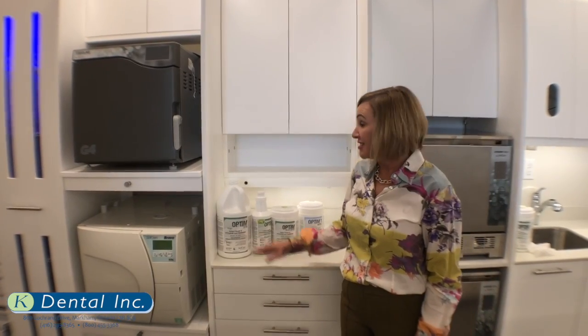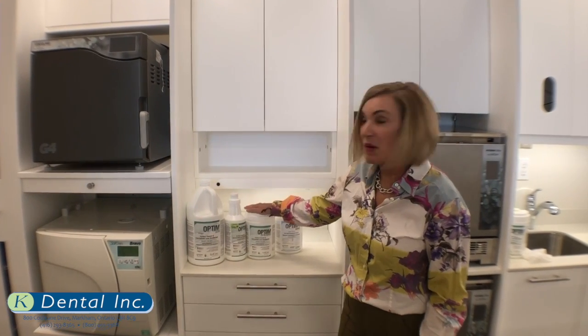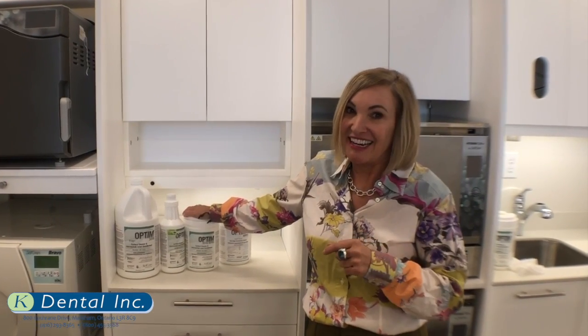The OPTIM line comes in a four liter jug, a one liter jug, and the most popular — the pre-soaked canister of wipes. Coming to Canada is new: the OPTIM 1.